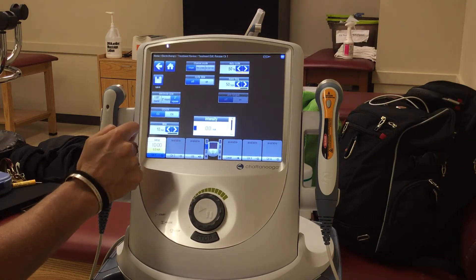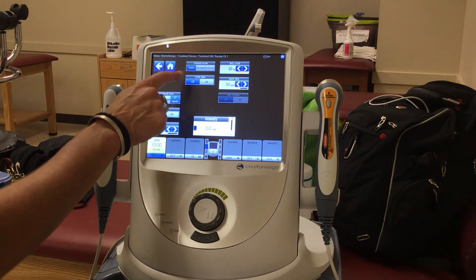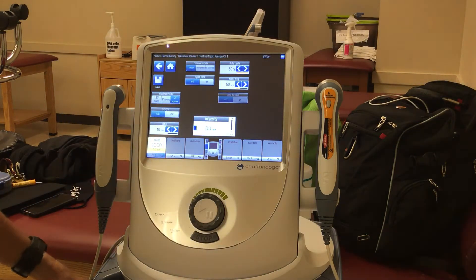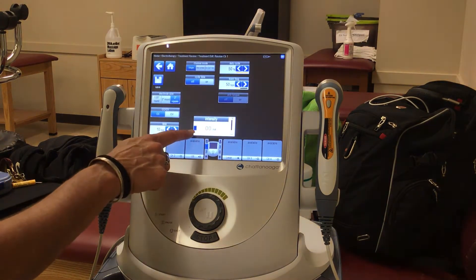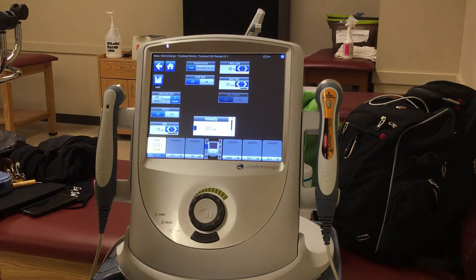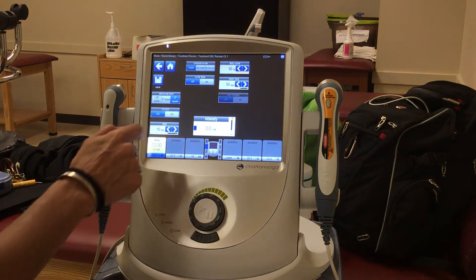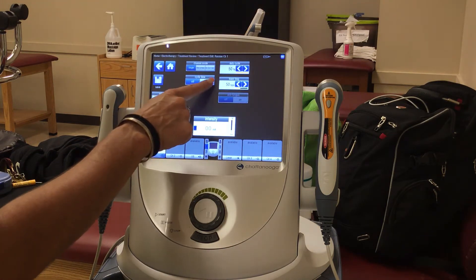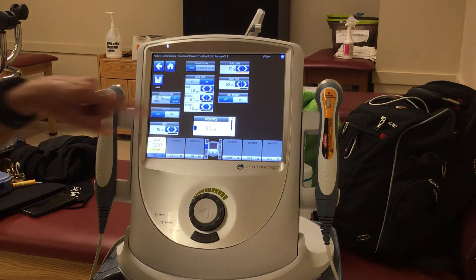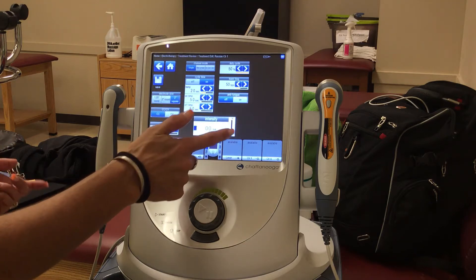Meredith is wearing the rectangle, so we're going to change to the 2-inch squares as we go through this. We want to keep it on single because we're just going to do a single, and we're still using this one blue lead — number one, and notice number one is right here. When we look at duty cycle time, we can leave it at 50. When we look at cycle time itself, it's set to off, but we need to change it to on. For ramp, we usually want it between 2 and 3 seconds, so we'll leave it at 2.